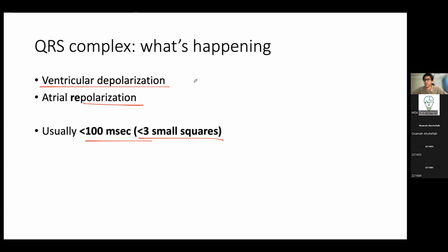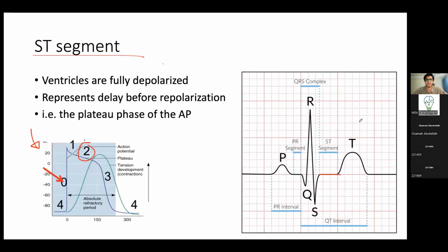And so, yes, I believe it's going to be down because, well, I'm not exactly sure how the atria are repolarized, because the ventricles are repolarized from the epicardium to the endocardium. So it could actually be up, right? Because it's a repolarization going away from the positive electrode, so the deflection might be up. All right, so to be honest, I'm not too sure about this. Why don't you look at it and let me know, all right? But it's not important. No one's going to ask you.